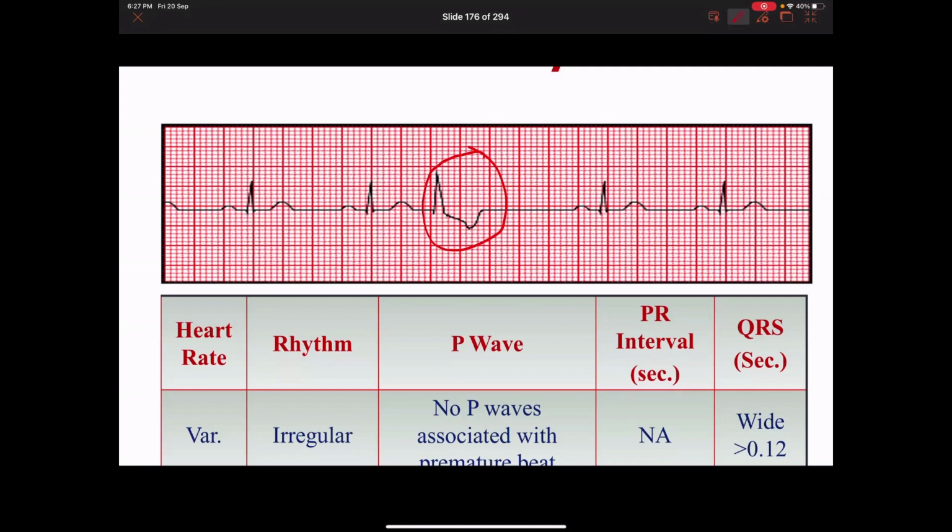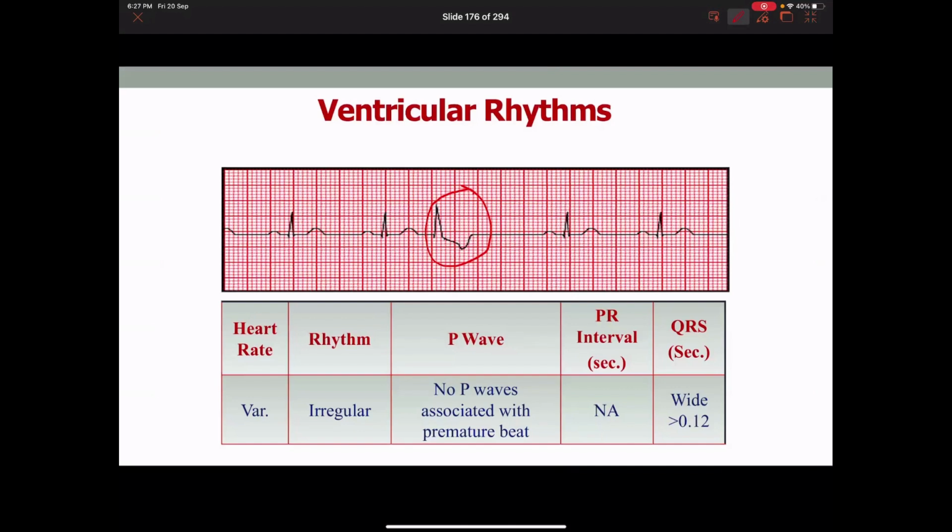So this is actually a premature ventricular beat, which means that this weird impulse that came in the middle here was from ectopic tissue in the ventricles. Sometimes you have ectopic tissue, which means tissue that's not supposed to be there, and it sometimes sends out random electricity. Okay, so that's why the QRS complex is very weird looking. Because it's not a normal ventricular contraction.